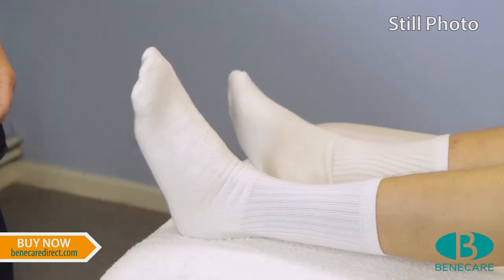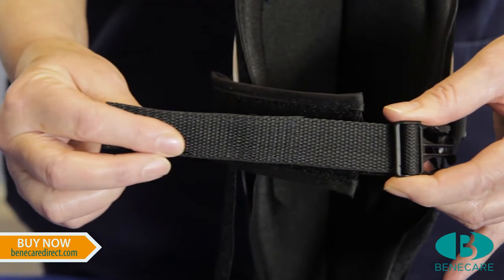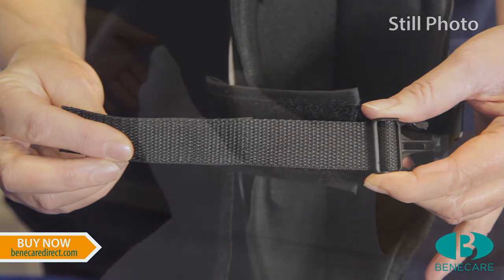To apply the night splint, choose the correct size of splint for the patient. Now adjust the circumferential straps to accommodate the size of the limb.